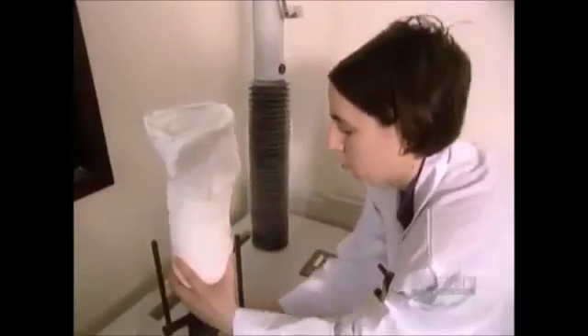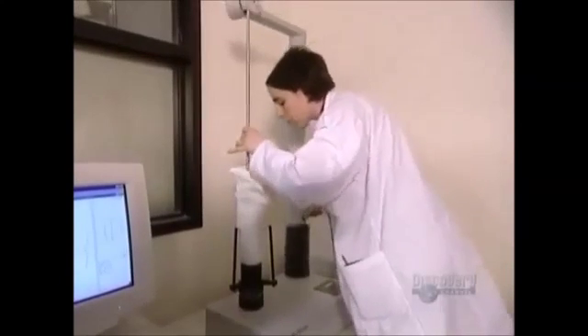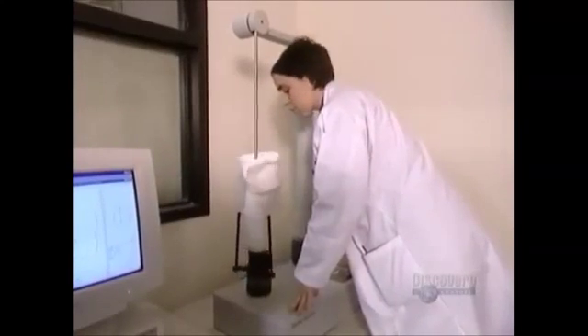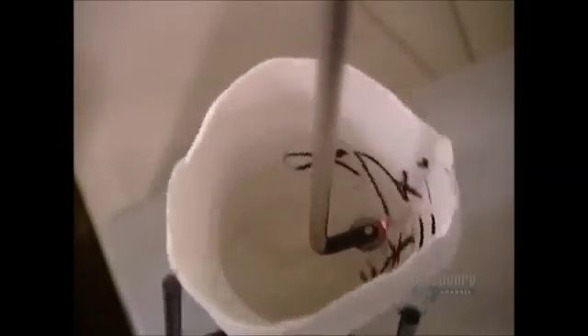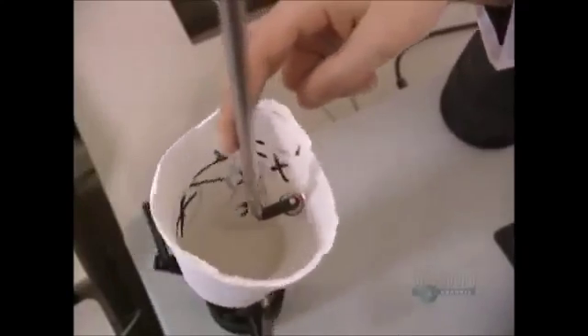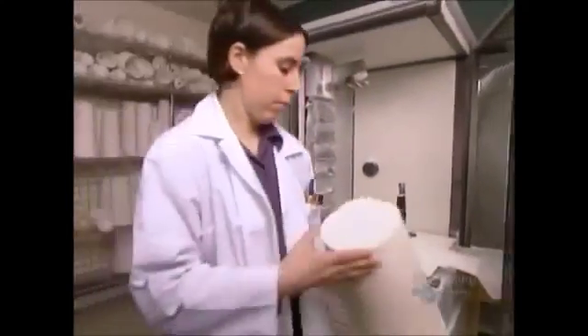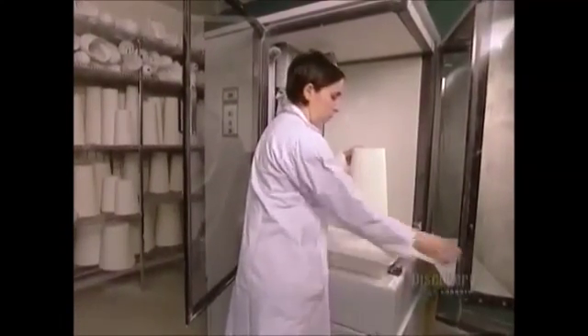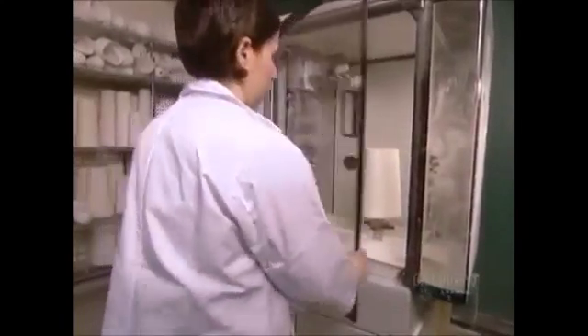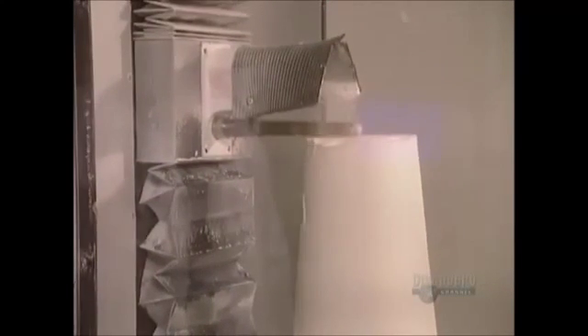Often, they use a different technique to make the positive mold. They build a negative mold first using strips of plasterized cloth, much the same way they make a plaster cast when you break your leg. Then a scanner takes a detailed three-dimensional reading and programs it into a computer. A technician makes any necessary modifications, and the computer guides a blade on a cutting machine to carve out the positive mold from a plaster block.